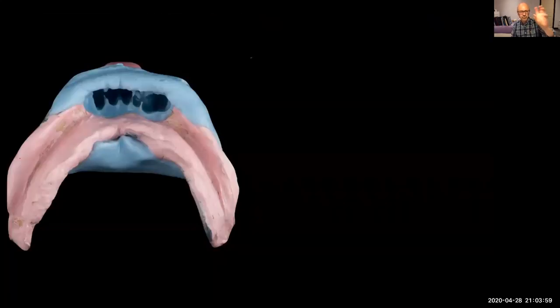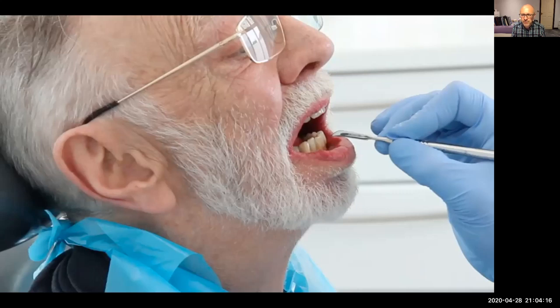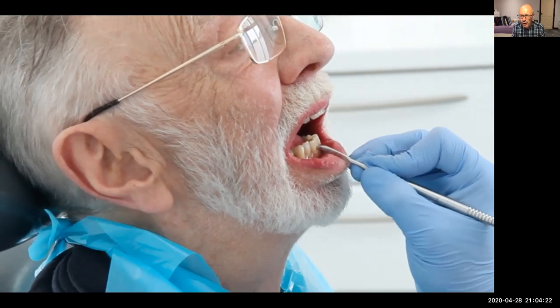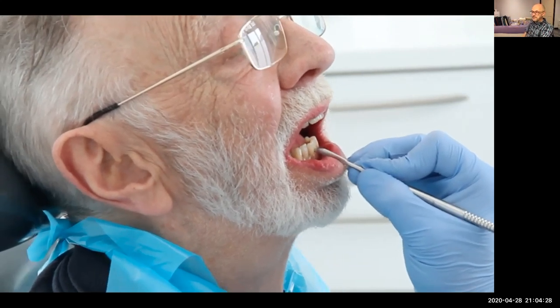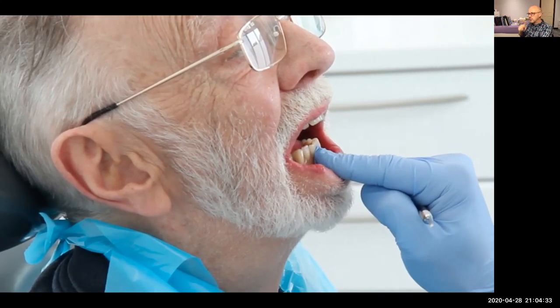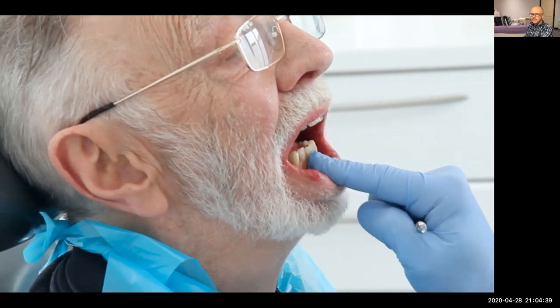So, and then what Rowan does is really carefully goes from that to the final denture, which gives us, basically, we've got all that border molded and the teeth didn't get in the way of my impression. And this is Bert at review. 1 week later, look at that. I can get a Lacron carver and push it right up. It's fantastic. I can get my finger on it and it's as solid as anything. He's helping me though with his tongue. It's fantastic. This suction denture effective technique.